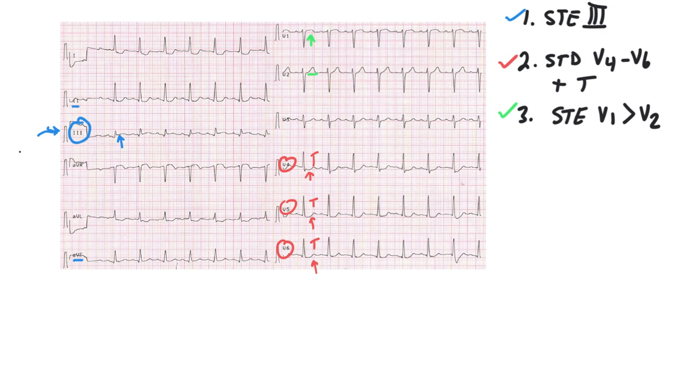There are also some other things of note that I want to point out. You can see ST depression in lead 1 here. And some ST depression in AVL. And these, of course, are reciprocal to the inferior leads. So we would actually expect that if we're thinking about an inferior STEMI. And that's, in fact, what, in many cases, the Aslanger pattern suggests, is an inferior STEMI.